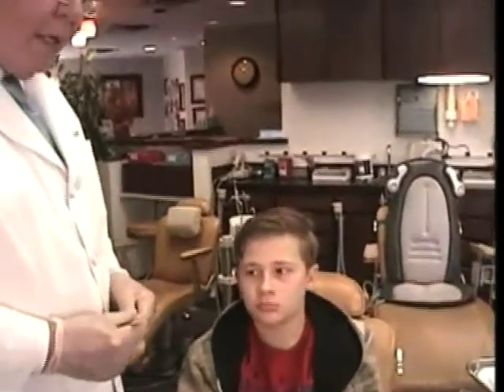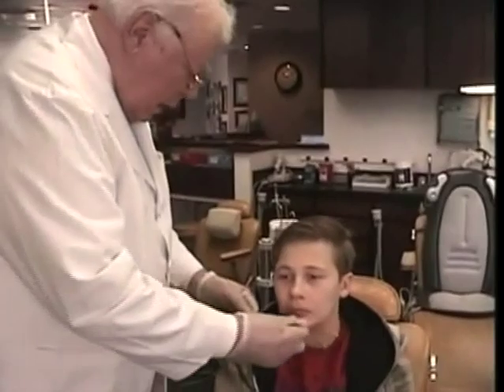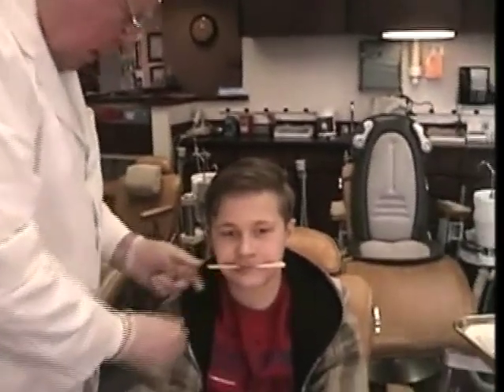The question always arises, how thick do we make it, how tall do we make it, how high do we make it? And one way to do it is by putting in popsicle sticks or tongue blades and varying the height up and down to see what makes the tics go away. We have done this on him and have determined that a height of 3 tongue blades drastically stops his tics. And so we are going to start with a height of 3 tongue blades initially for his mouthpiece.